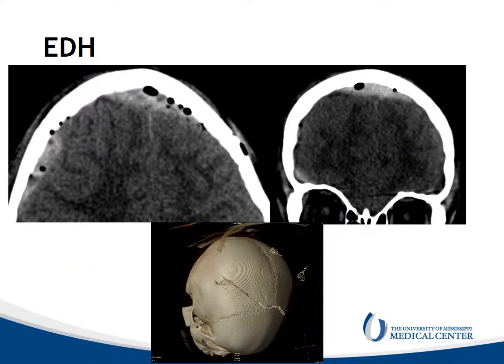This is an epidural hemorrhage. This is a five-year-old who had a fall on his head. We can see that the hemorrhage is somewhat lentiform in shape. We can see that it does cross the falx anteriorly, and it does not cross the coronal suture. Small foci of air are present reflecting pneumocephalus, and there is a linear skull fracture seen on the 3D rendering.